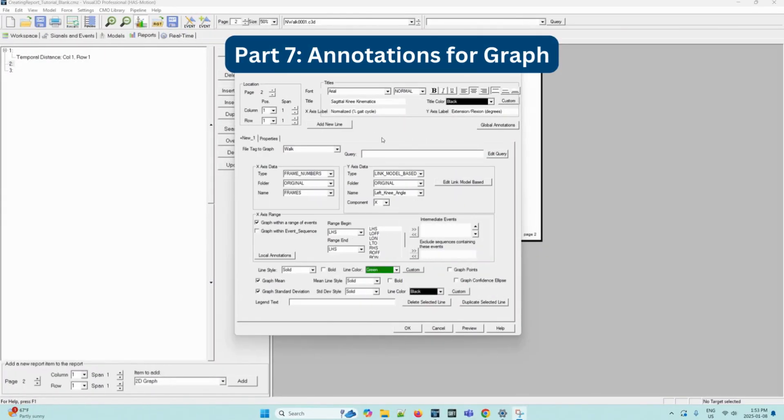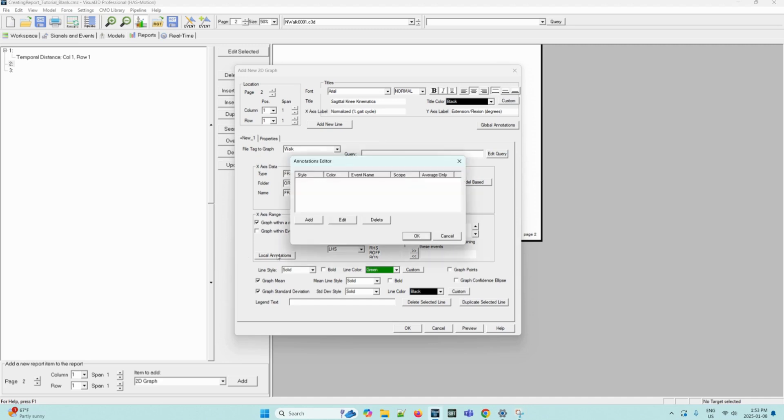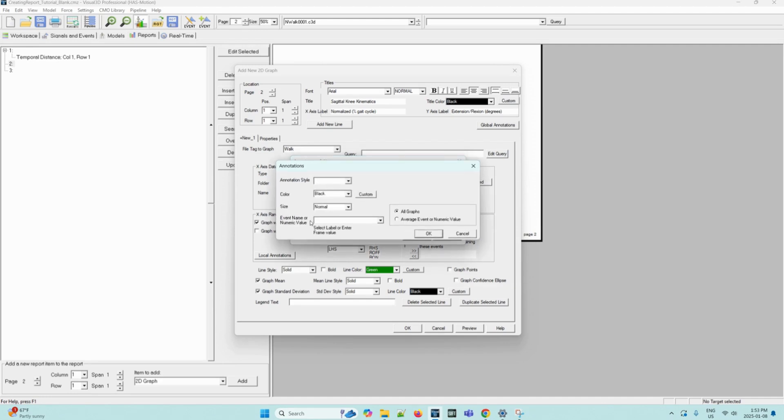Next, we can add annotations. The annotations option allows you to view annotations on the graph based on events specified in your dynamic trials. First, we select the local annotations button here. Once the annotations editor dialog box opens, we can click add. Then we can fill in the following options.